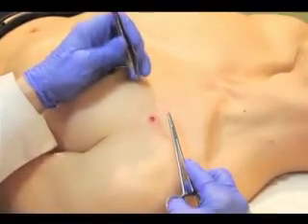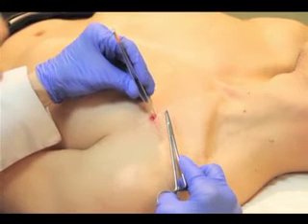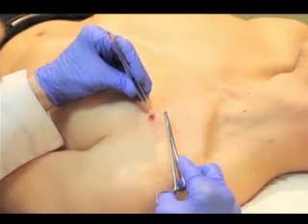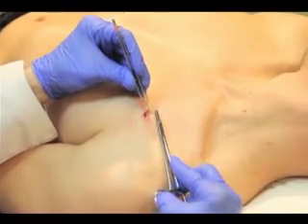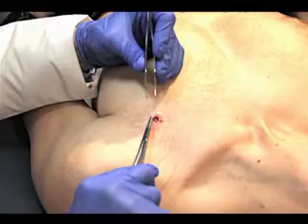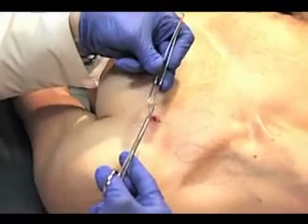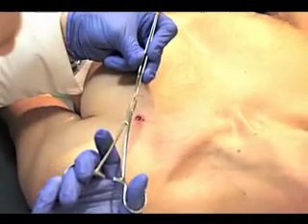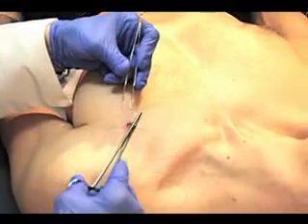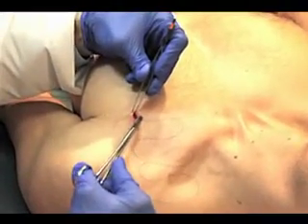When you have finished the biopsy and obtained the specimen, you may suture the wound. Place the sutures perpendicular to the long axis of the punch defect and perpendicular to the skin tension lines. Begin by placing the needle through the edge of the wound. Release the needle and, keeping your palm down, grasp the point with the needle driver. The wrist curves naturally, which directs the blunt end of the needle to your forceps. Reload the needle driver. Next, pierce the opposite edge of the wound with the suture.